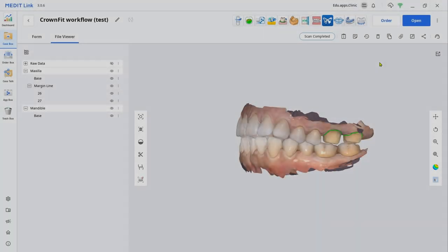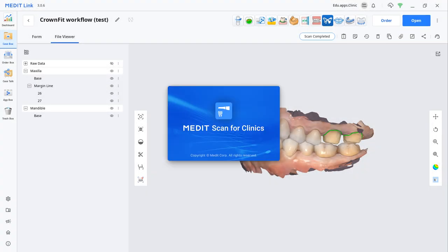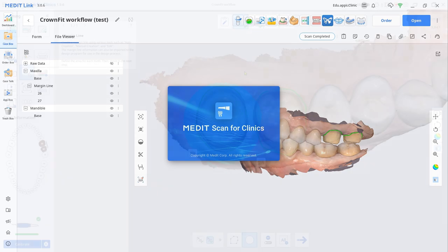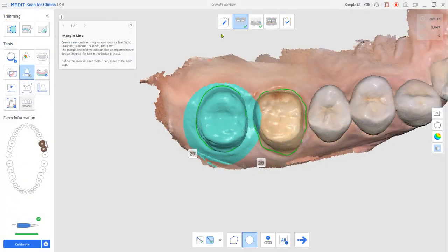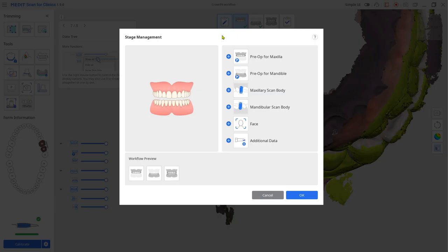Once you receive the milled crown, open the same case. Go to stage management from the top and add the additional data for the milled crown scanning.